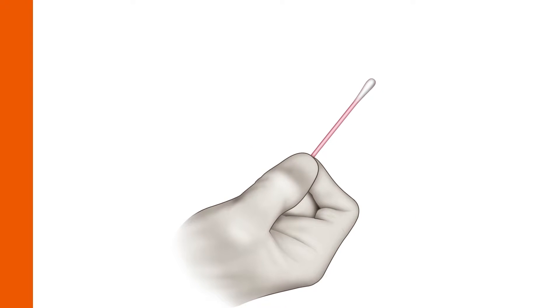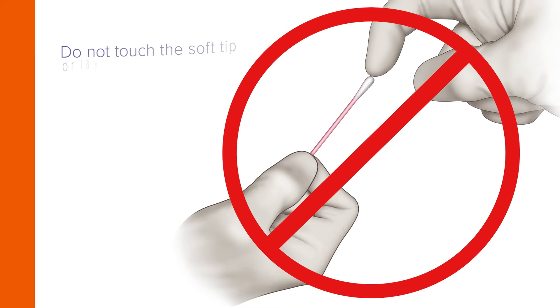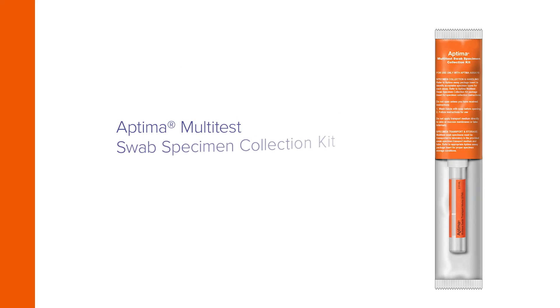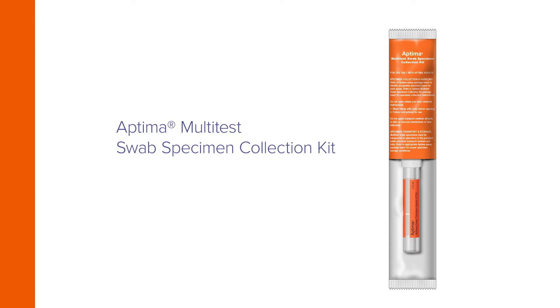Start by removing the swab from its package. Do not touch the soft tip or lay the swab down. If the soft tip is touched, laid down, or dropped, discard it and get a new Aptima Multi-Test Swab Specimen Collection Kit.